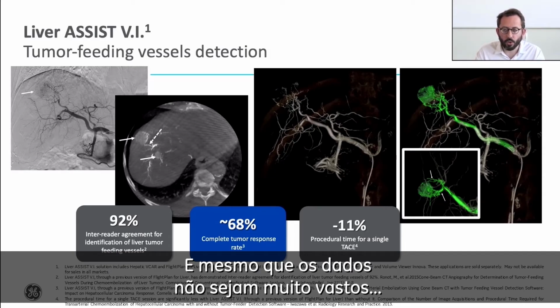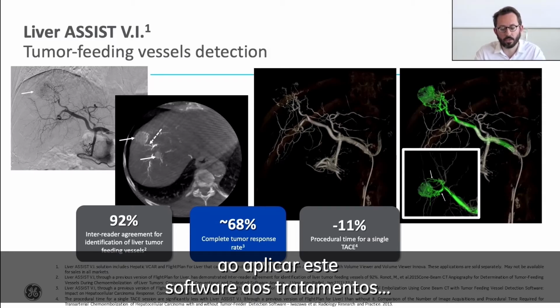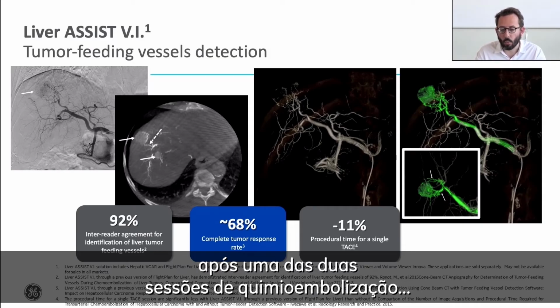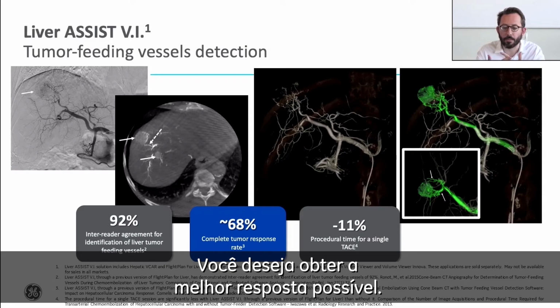And even though the data are not very large, we have evidence showing that when you apply this software to a treatment, you will have an increased rate of complete tumor response after 1 or 2 sessions of chemoembolization, which is a key prognostic factor for those patients. You want to obtain the best response you can get.